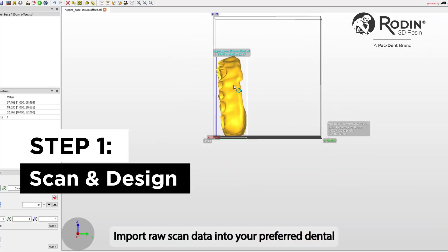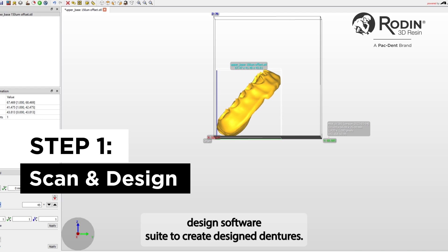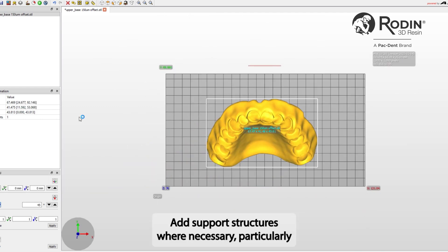Import raw scan data into your preferred dental design software suite to create design dentures. Add support structures where necessary.